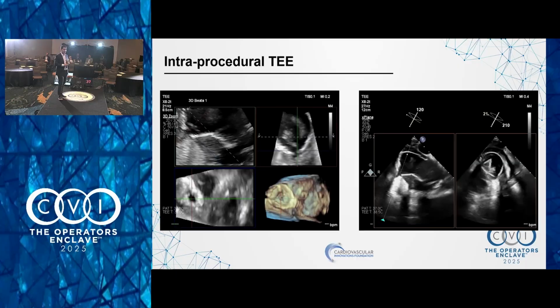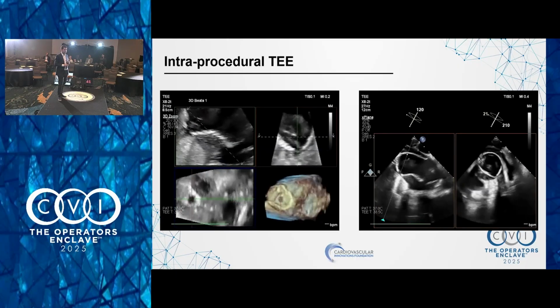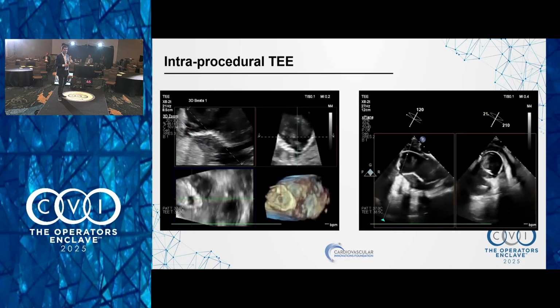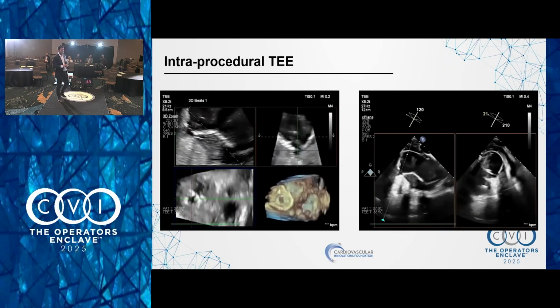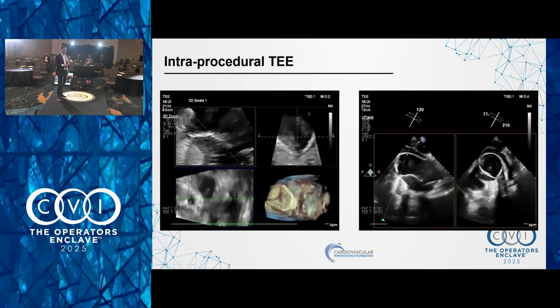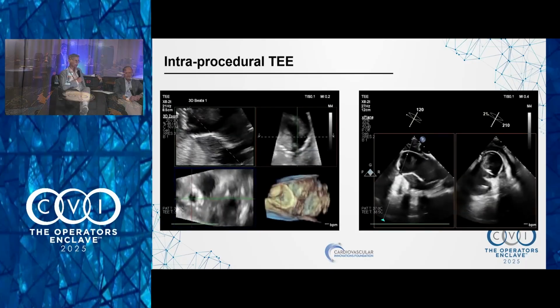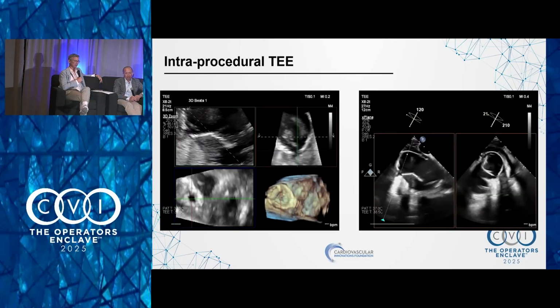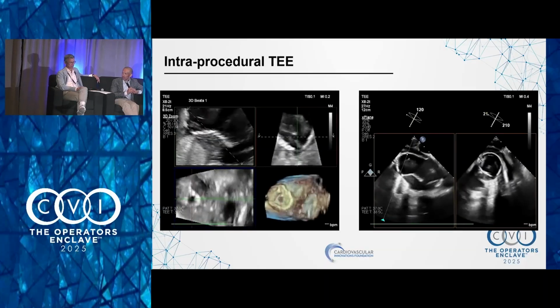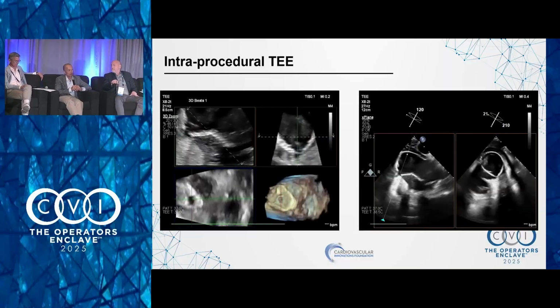I like Kashish's idea of doing the AVP 2 first and then having the stent there in place. The one thing is that the AVP2 has a hub, right? There's this little thing sticking out, and that's right where you're going to put the stent. So you have this little metal projection, so maybe that interferes with the stent. But I'd probably just use a regular DES. I don't like putting covered stents in native coronaries if you don't have to. Those AVP2s are designed to clot, so anything hanging in that area just creates a little bit of unknown risk.